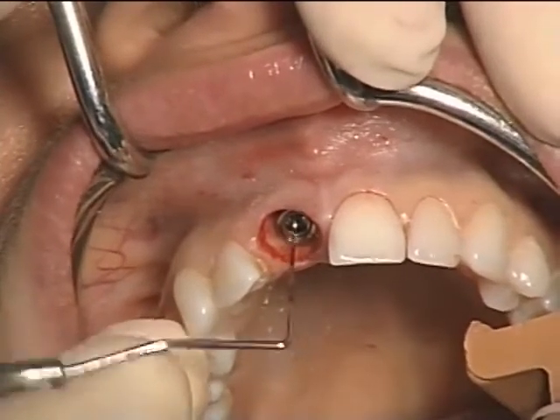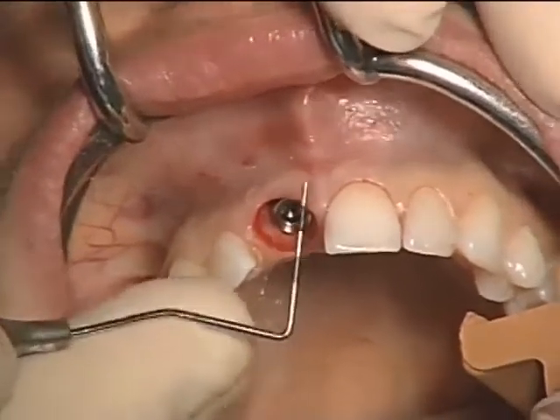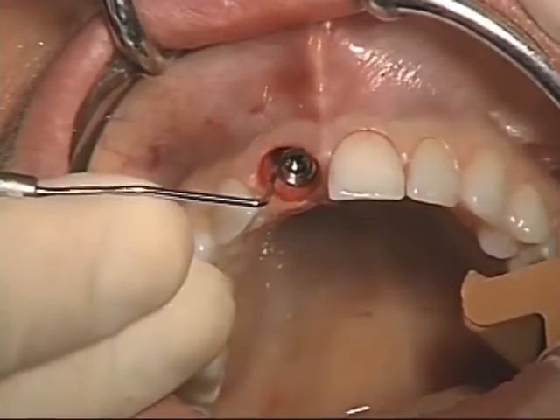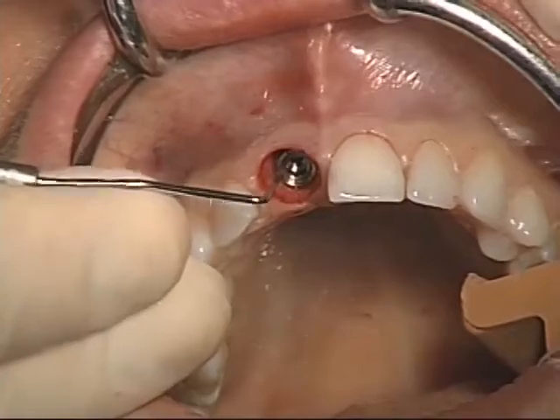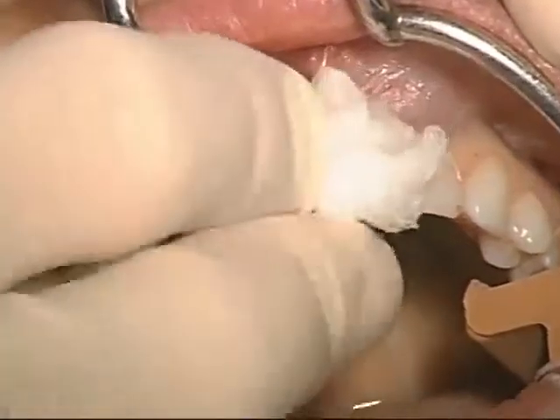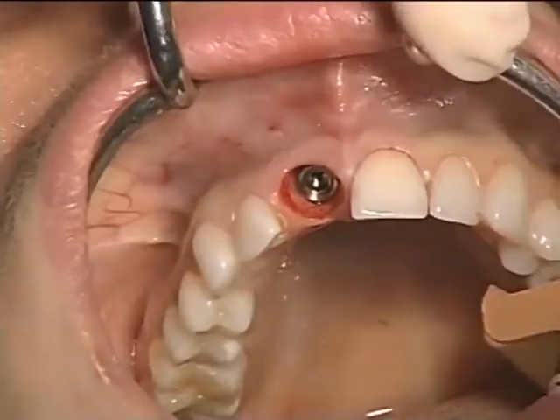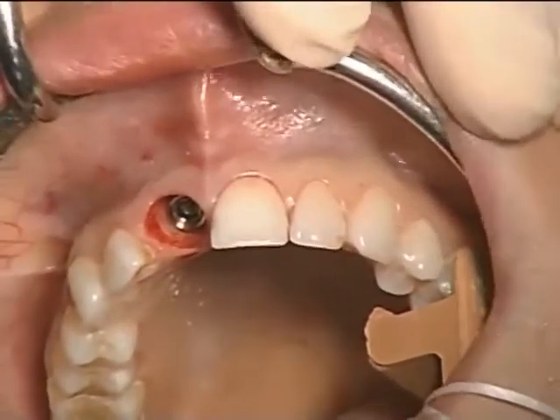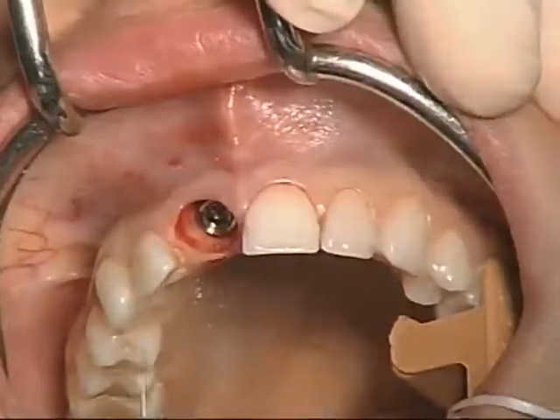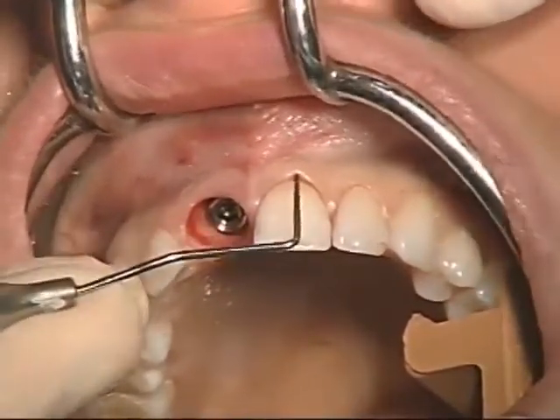And as we discuss in our classes that we do here at the Institute, the collar itself is subcrestal mesially, distally, buccally, and palatally, but supracrestal within the depth of the extraction socket. Thus, the temporary acts to support the tissue, provide space maintenance for the grafting material, and allow the keratinized soft tissue to migrate along the side of the provisional, hence forming a nice seal to the collar of the implant itself. And we're just confirming our readings that the collar is at or slightly apical to the facial height of contour of the buccal plate.